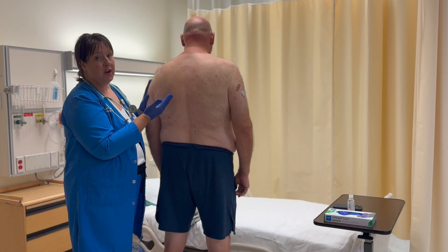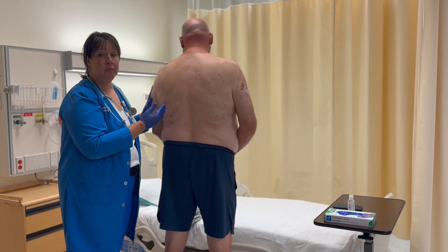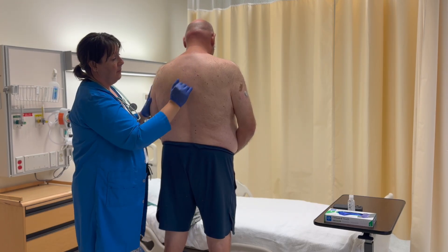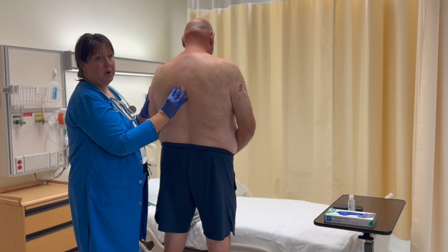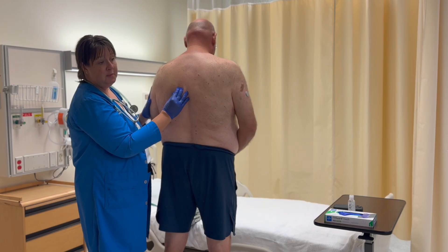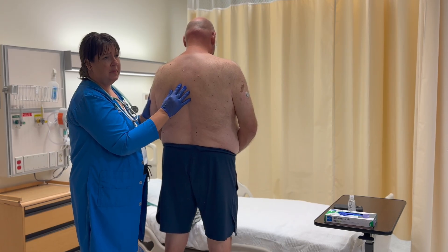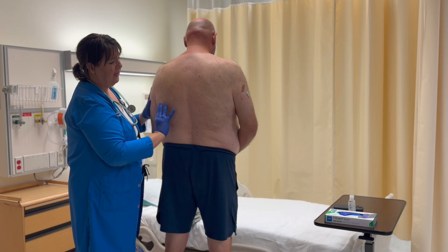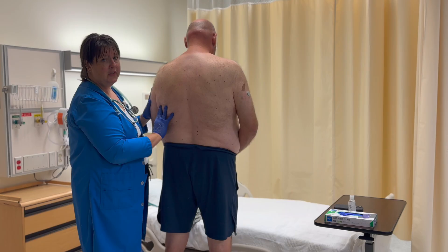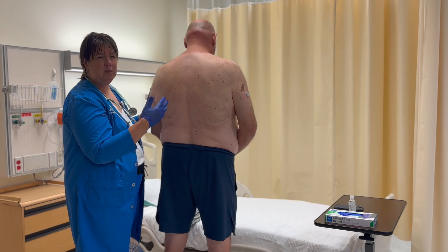Here is what I'm going to note for the purpose of education. When listening for the different types of breath sounds, up here and down the center of the chest — the center area — is where we're going to hear our bronchovesicular sounds. Bronchovesicular tends to be moderate tone and pitch with mixed sounds. When I listen on the outer area — the periphery — this is where I'll hear vesicular sounds: low-pitched, soft, like the wind rustling through the trees.